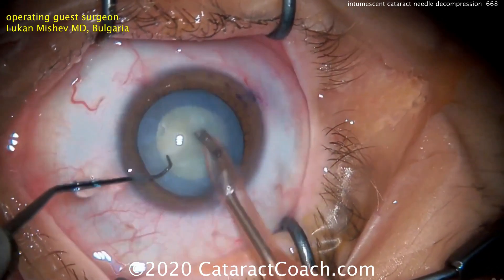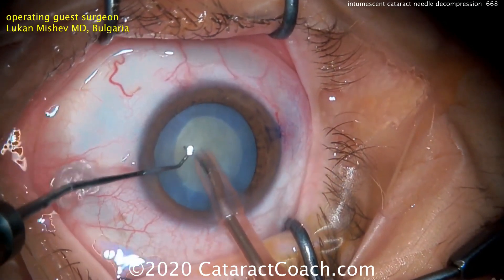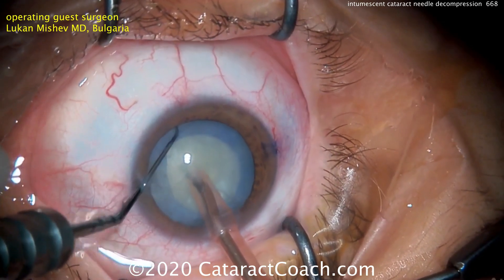You can see it's a beautiful capsulorhexis and now time for the little chop technique. This is always fun to watch. Dr. Mishev is a fantastic surgeon.